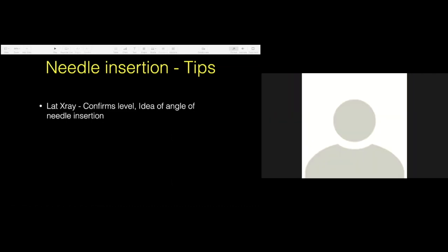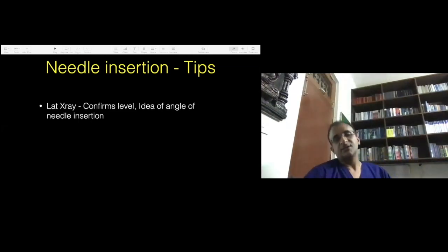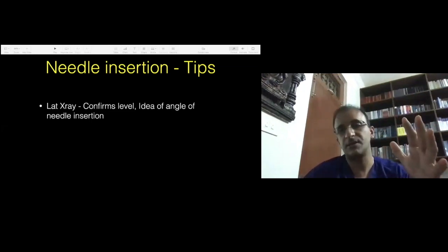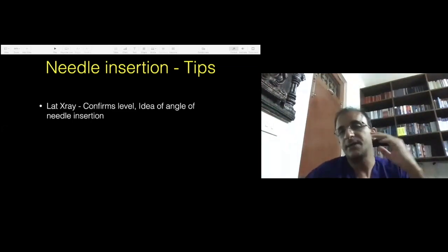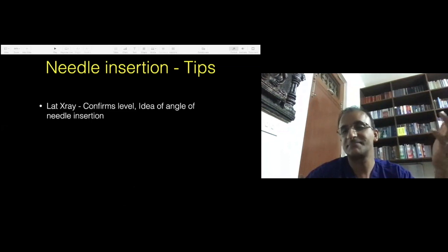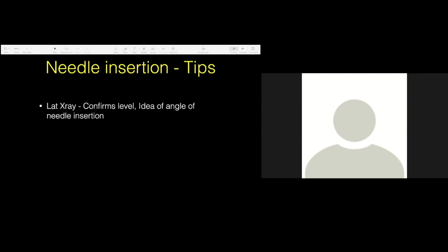Yes, sir. Friends, is it clear? Yes, sir. Okay, so what I am trying to teach you is a lateral transforaminal surgery and not posterolateral, and how I mark. So that's very important. I hope you all are digesting all this. Is it clear till now? Yes, sir. Very well.